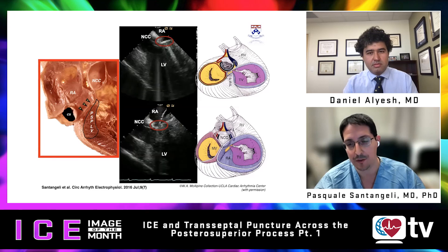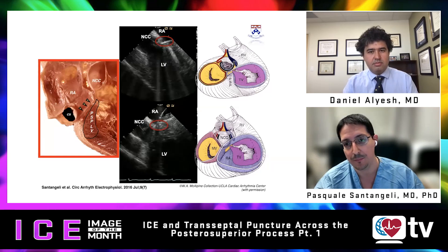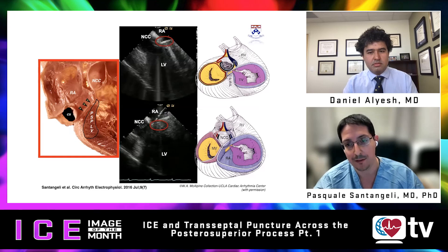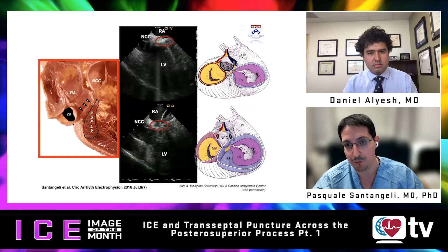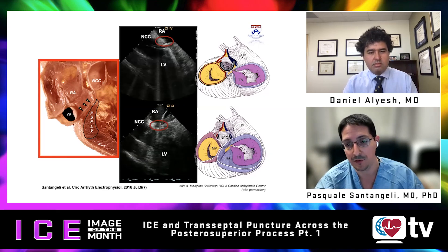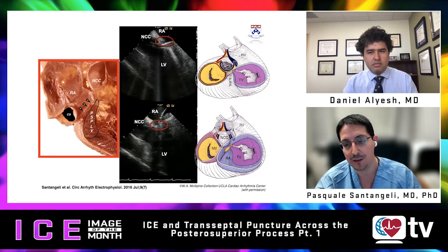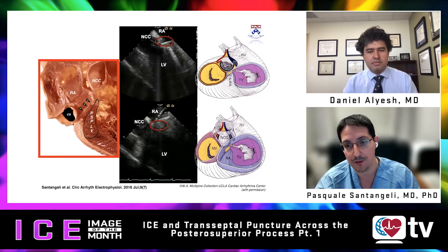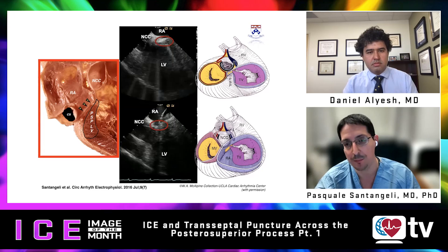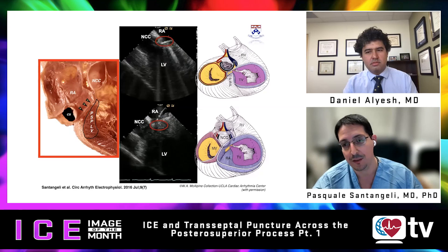In the top ICE image, an ablation catheter is deployed in a retrograde aortic fashion right under the non-coronary cusp, in contact with the left ventricular endocardial aspect of the inferior septal process. In the bottom ICE image, a catheter is deployed from the right atrium, touching the opposite side of the inferior septal process. PVC suppression was achieved from the right atrial aspect.